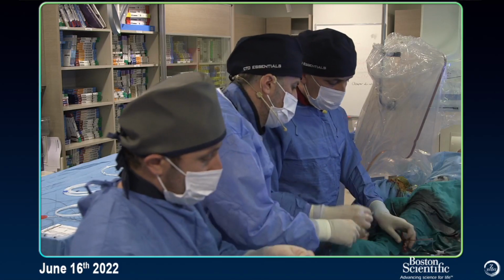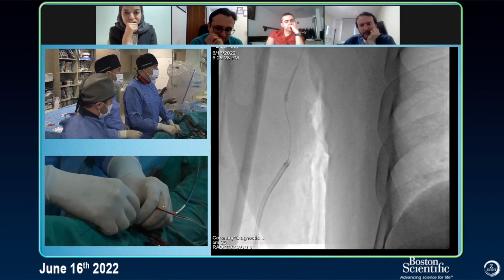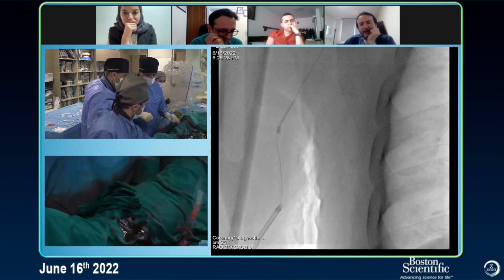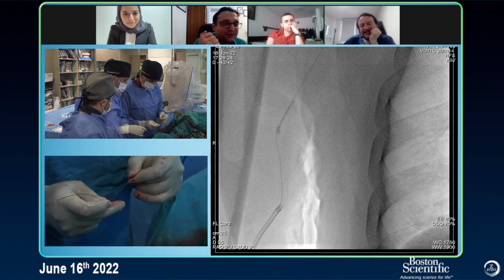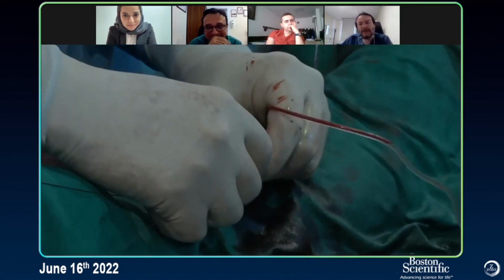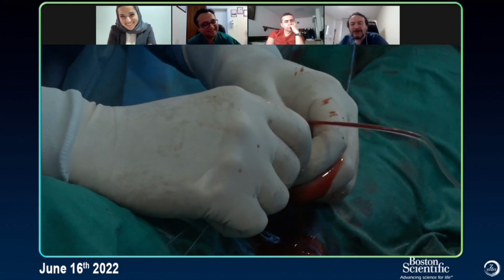Actually, it happened to me some time ago. Do you have it? Yeah, of course. Everyone had it. No one confesses it. The good thing is you can still see it. Sometimes you can't see it, and that's the best part. If you can't see it, then the problem is solved. Done. There's no problem. But now you have to struggle.